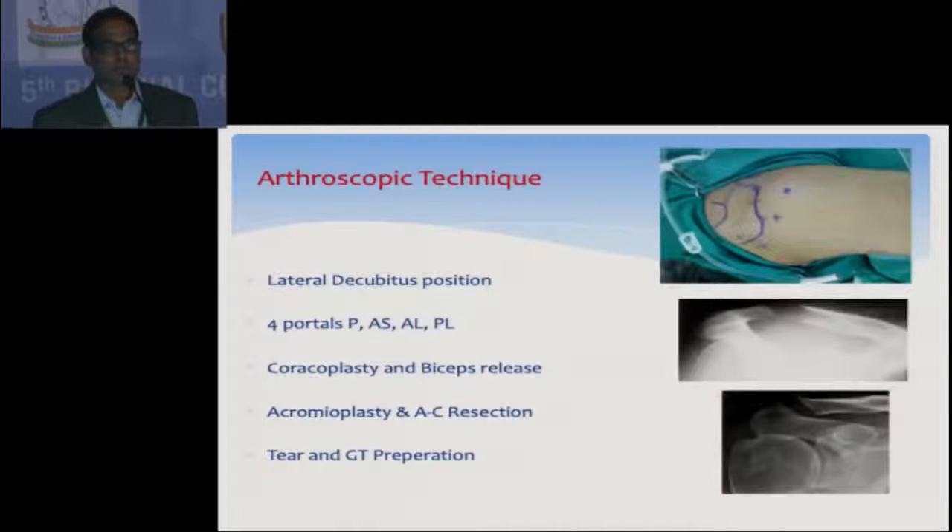I do arthroscopy in the lateral decubitus position with portals: posterior, anterior superior, anterolateral, and posterolateral.